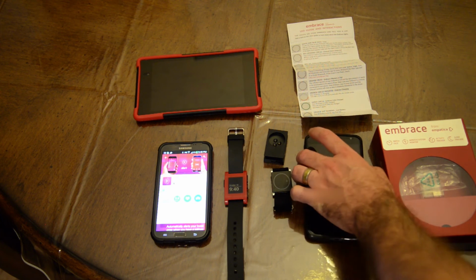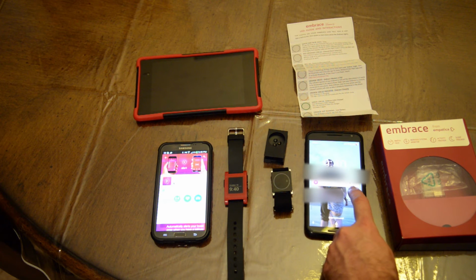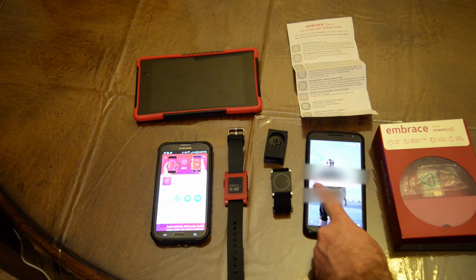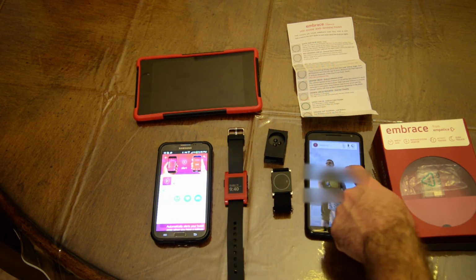Let me turn this off and on because it has a cool display. As you can see, you can just turn that on, and it'll tell you, night mode's off. You have 100% battery power for this watch, and the memory is free. The Embrace is connected, and it is okay. So no issues there, none at all.